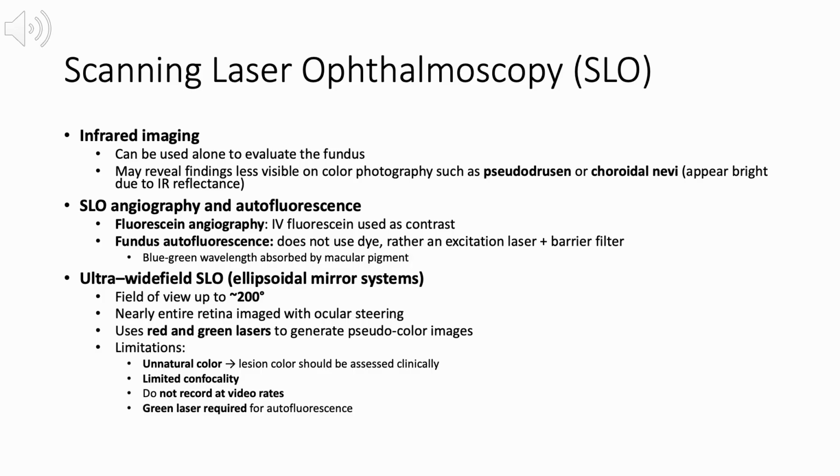Fluorescein angiography is performed using intravenously administered fluorescein as a contrast agent. In contrast, fundus autofluorescence does not require dye and instead uses an excitation laser with a barrier filter. Blue-green wavelengths are absorbed by macular pigment, influencing the autofluorescent signal.